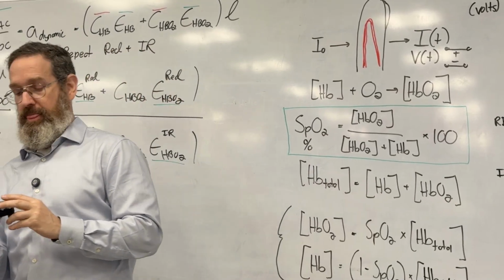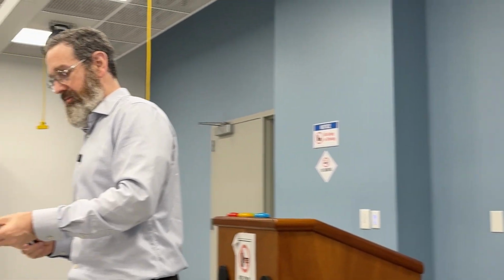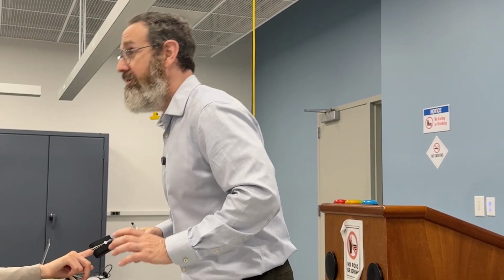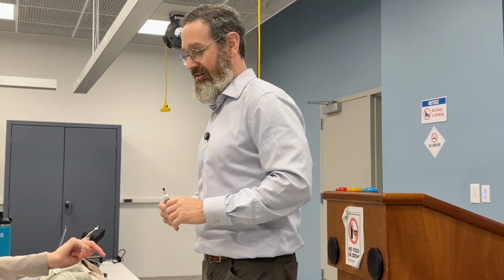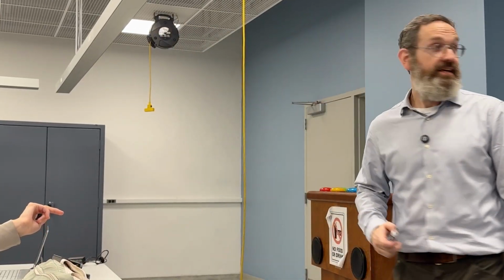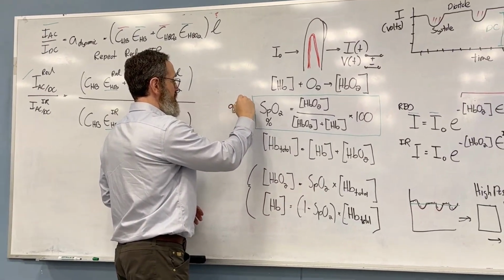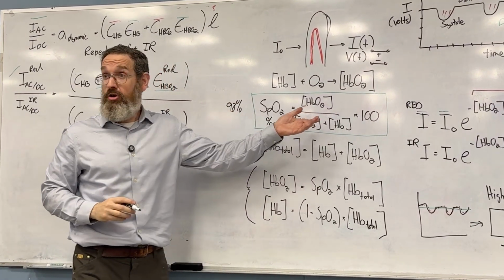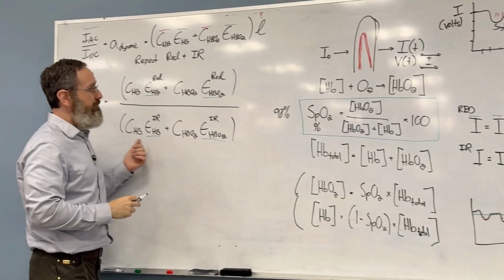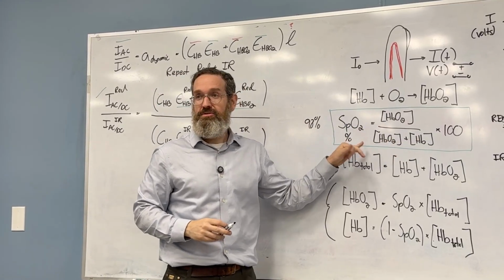Let's see. Right, Emily, you want to put it on? And Adrian here is a paramedic, so if we have a problem. What are you, EMT? Yeah. EMT. What's it reading? 98. So it's telling us that Emily is at 98%. And we got Emily's heart rate as well. Very good. Wait, but it can't do that because it doesn't have these parameters.